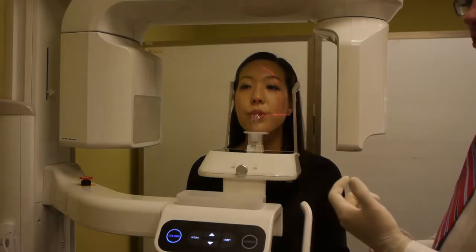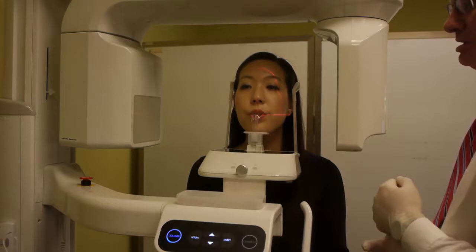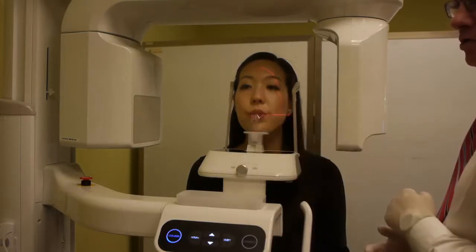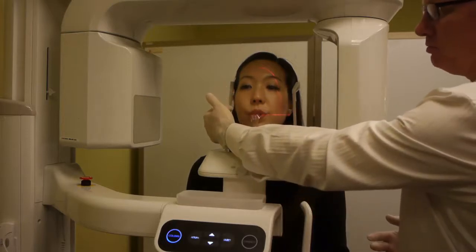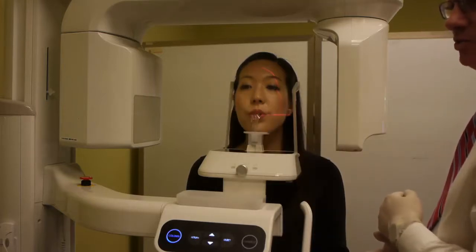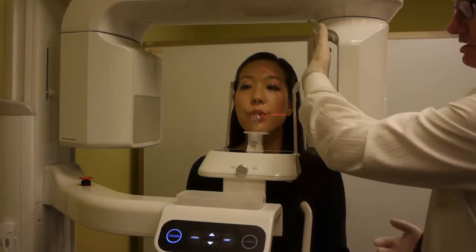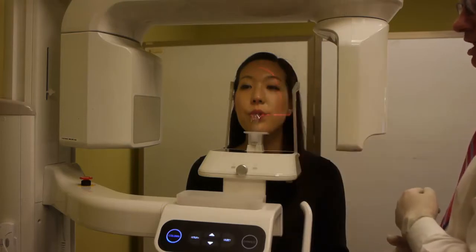In this example, we're going to do 8x8 occlusal right, which means that because we chose occlusal, we want the upper arch and lower arch. We chose right, which means we want to capture the maxillary on the right-hand side, and also the mandible on the right-hand side as well. We also chose the right-hand side because the lights for our CT are always going to project on the left-hand side of our patient.